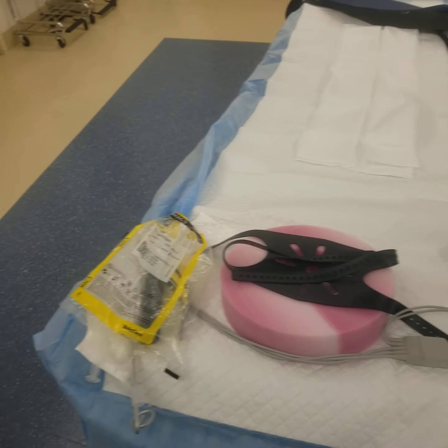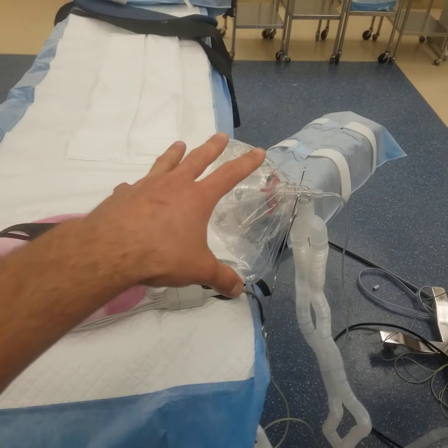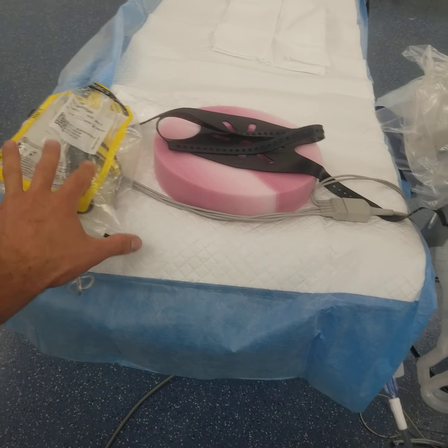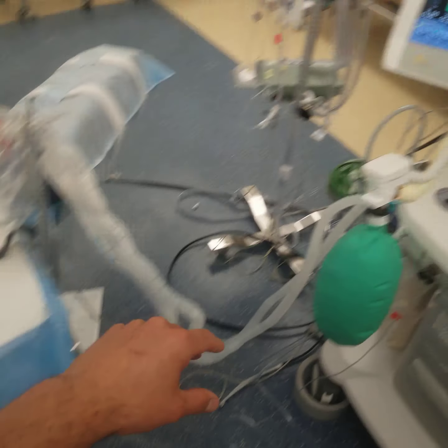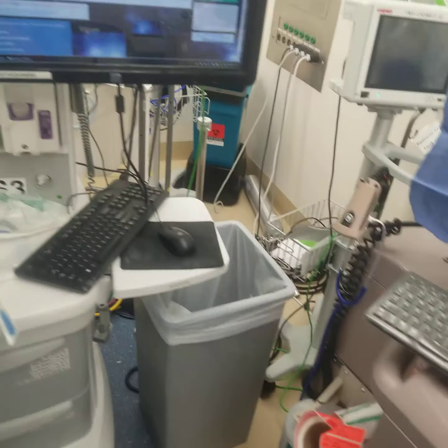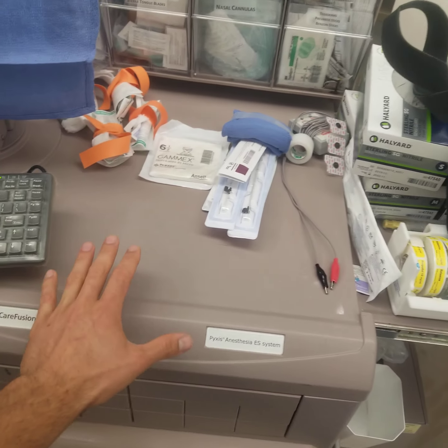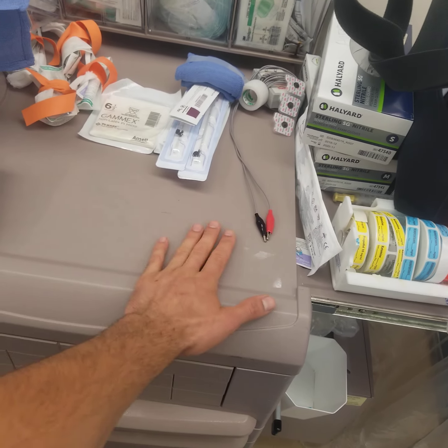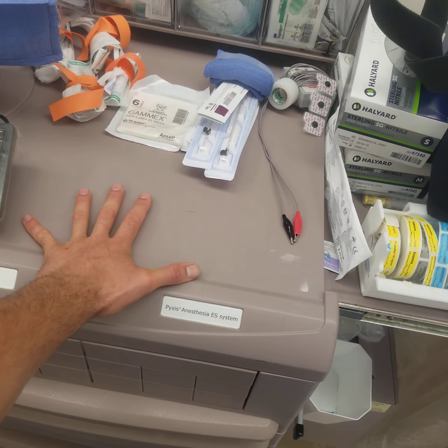And so now when someone comes in to start the case with you, you've got the patient already been pre-oxygenating for minutes. Your airways are ready to go right here. Your suction's right at your side. You got your monitors on. They're cycling appropriately. Your vital signs are running. Since you open your Pyxis, you've given a little bit of pre-medicine, if that's what you guys agreed to. You have all your other meds up here and ready to go, okay?